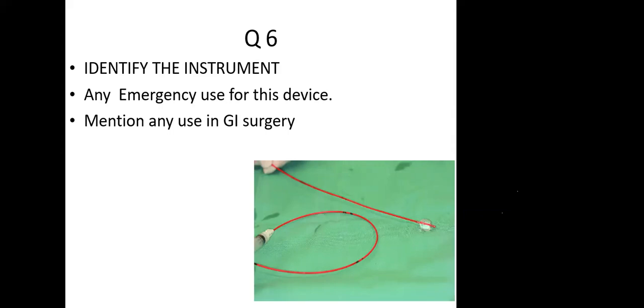Do you do the embolectomy on the distal side? Say, for example, there has been an injury in the femoral artery. I'll give you a technical example. You have repaired or you are planning to repair that. Before you release the clamp, you are trying to do the embolectomy. Which side will you do the embolectomy first? Towards the popliteal side or towards the iliac side?